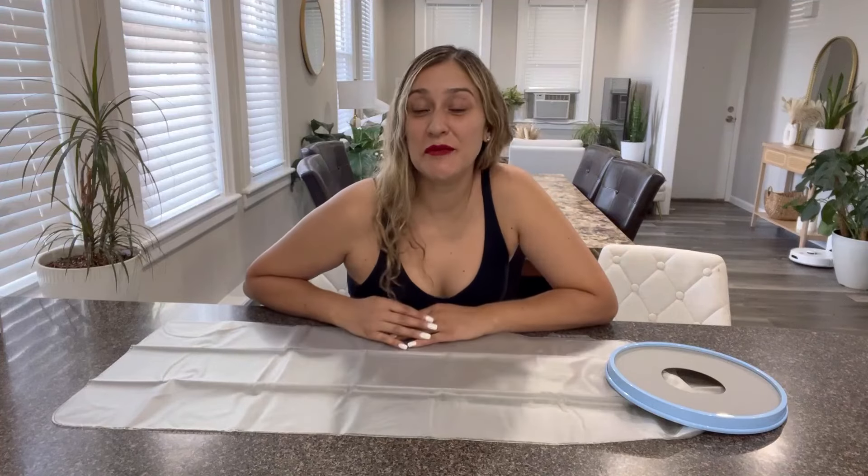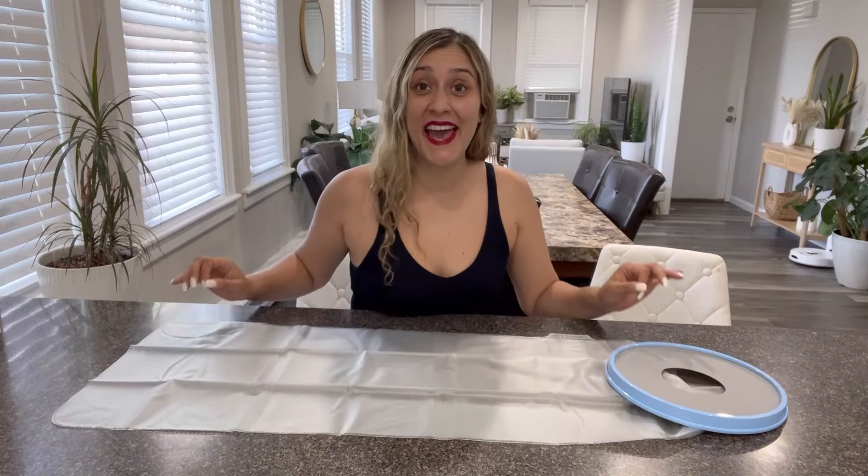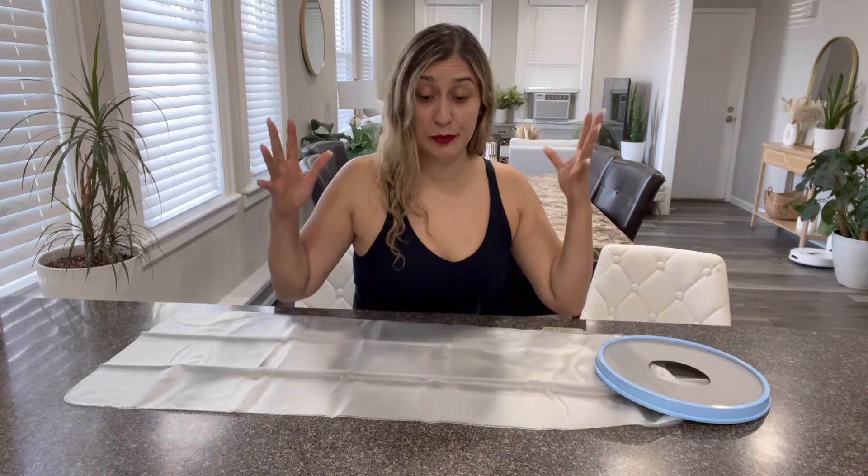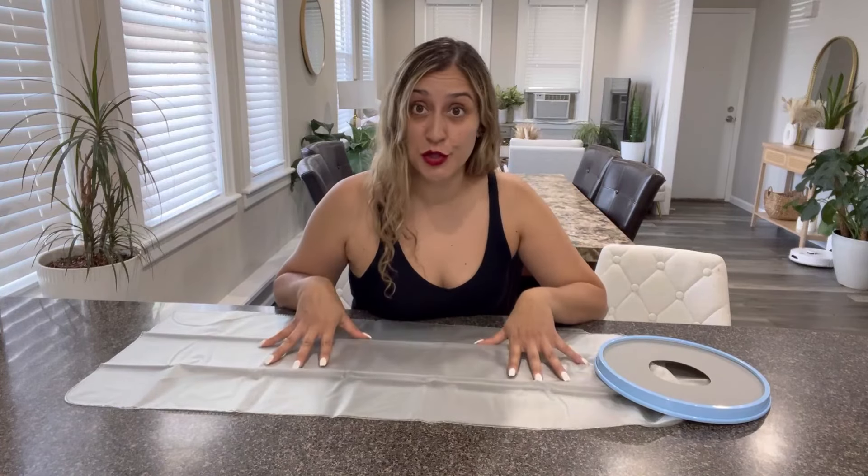Hi friends, so today I would love to share with you this leg cast and bandage protector. This product is amazing. If you need to take a shower or completely submerge your leg in the water, this is the solution for you.